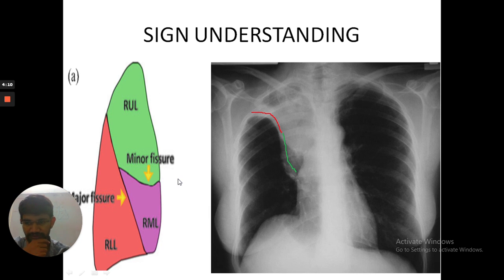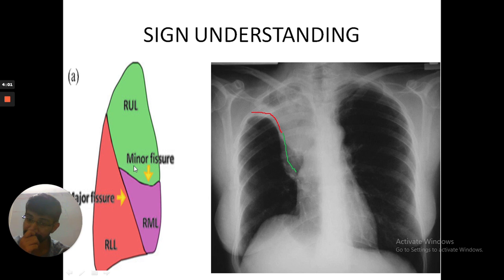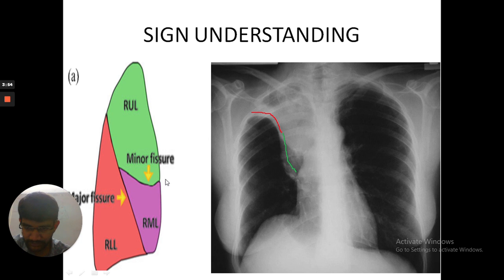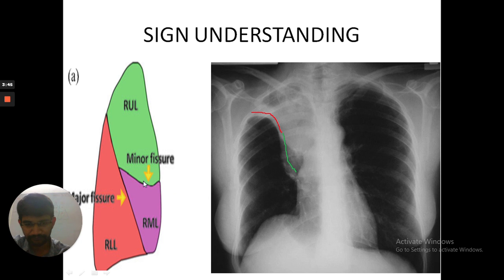On the left of the screen, you can see the right upper lobe. There is a minor fissure which separates the right upper lobe and the middle lobe, and the major fissure which separates the middle and the lower lobe. As you can see, the minor fissure — please follow my cursor — is more or less parallel, a straight line in normal anatomy.